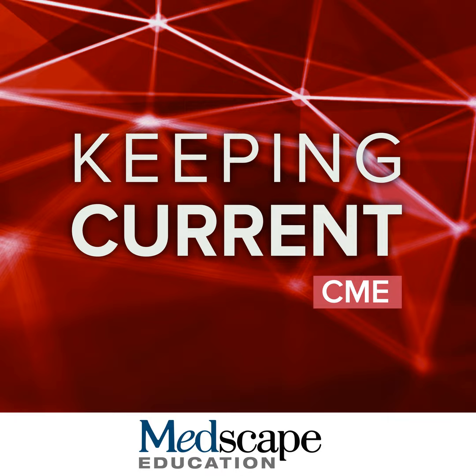So, few take-home points. Remember that hepatobiliary agents offer advantages for liver detection and characterization for both healthy livers and cirrhosis. There are technical, interpretive, and operational pitfalls. If you create dedicated and optimized protocol for gadoxetate MRI, that will help to minimize some of these pitfalls.